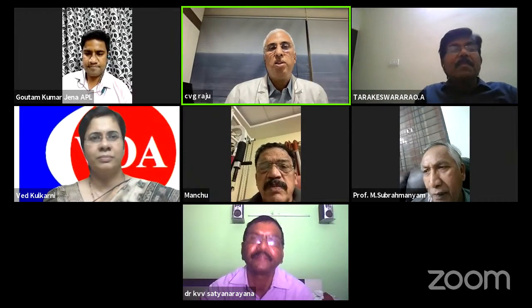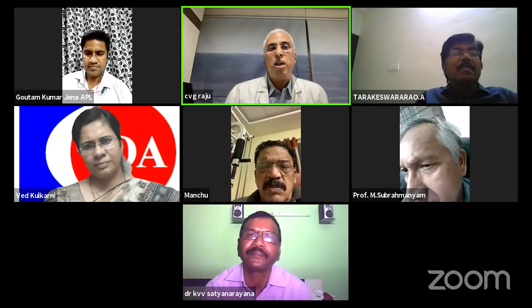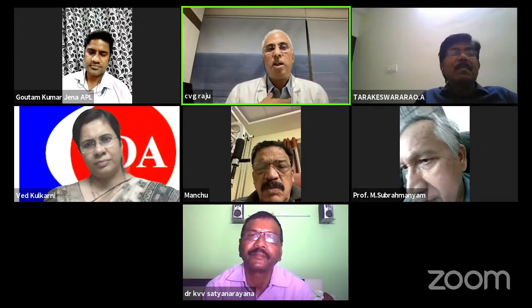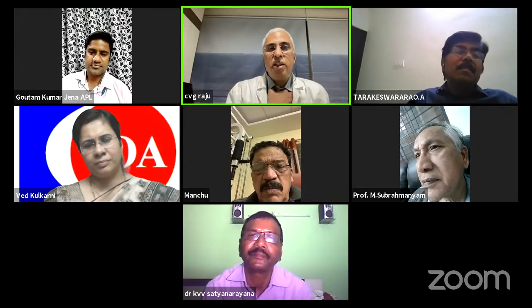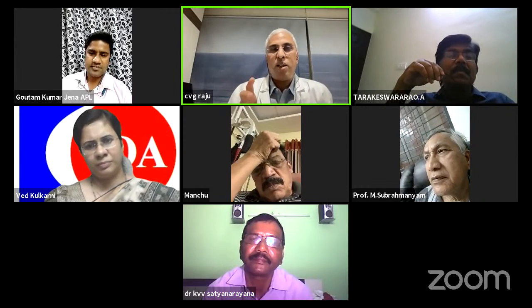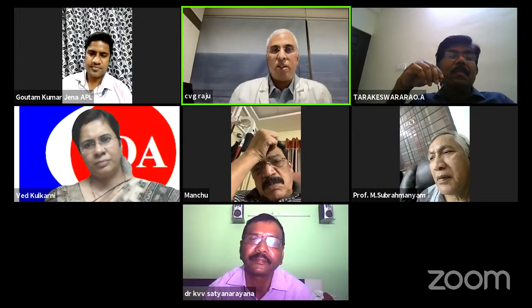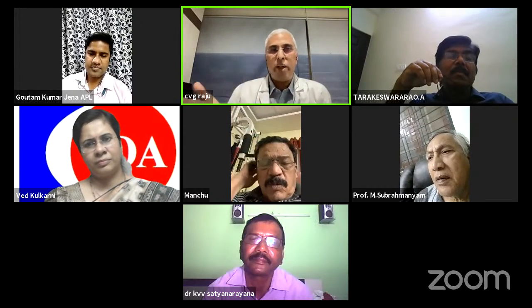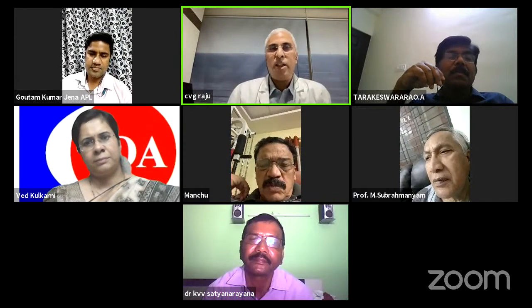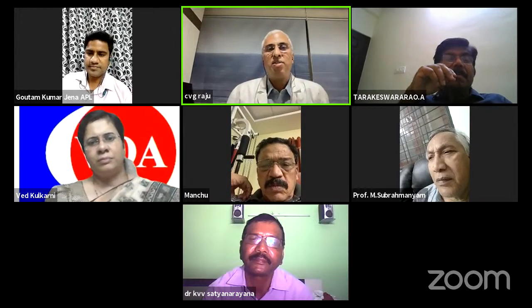One more question: is every RNFL thinning diagnostic of glaucoma? Yes, that is the first possibility to consider in all RNFL thinning. Whether the thinning is focal or global is another point you have to consider. If it is global, then glaucoma may not be the first option. If it is focal, definitely glaucoma is the first possibility.